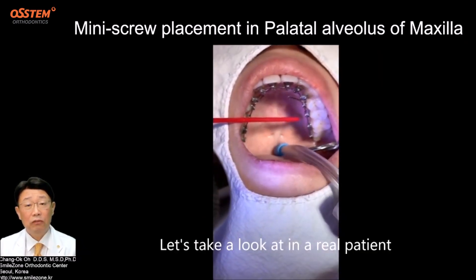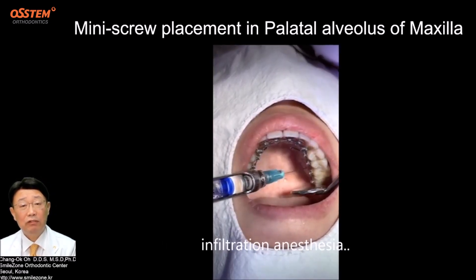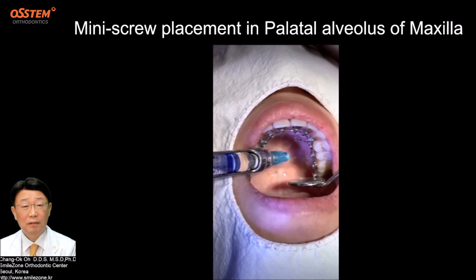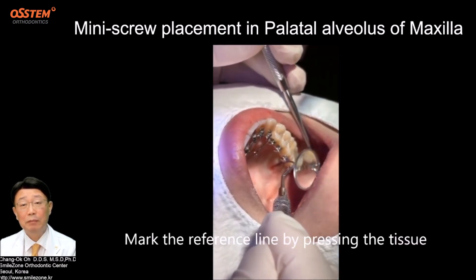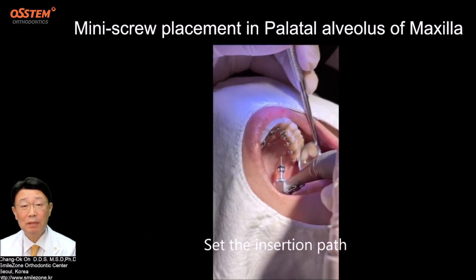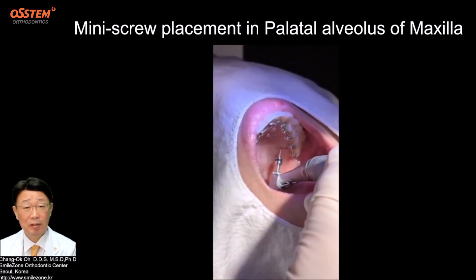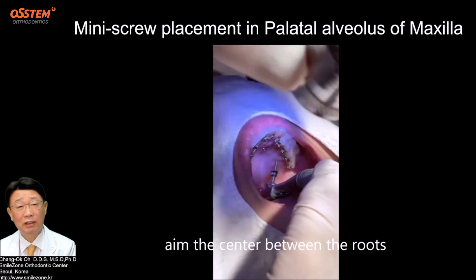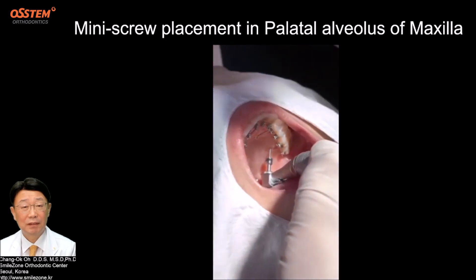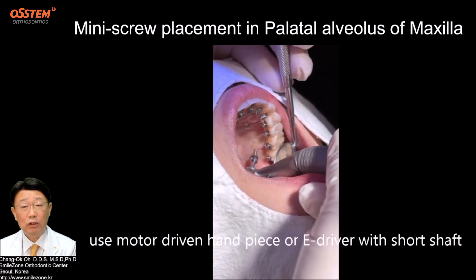Let's take a look at a real patient. Apply topical anesthesia, then infiltration anesthesia. Mark the reference line by pressing the tissue. With a 1.6 mm diameter, 8 mm long screw, set the insertion path perpendicular to the surface. Aim the center between the roots. Use a motor-driven handpiece or e-driver with a short shaft.